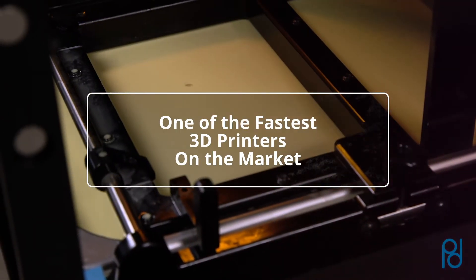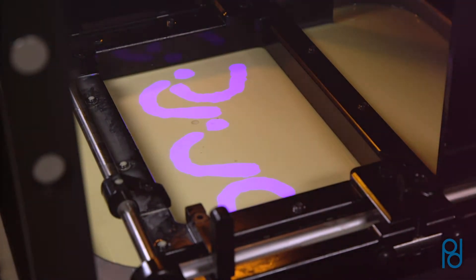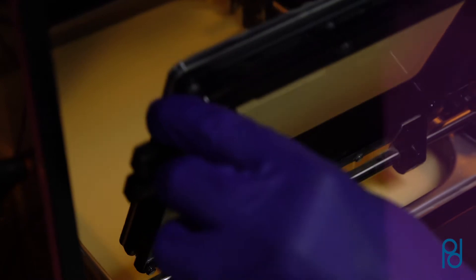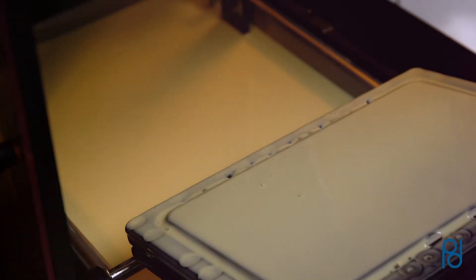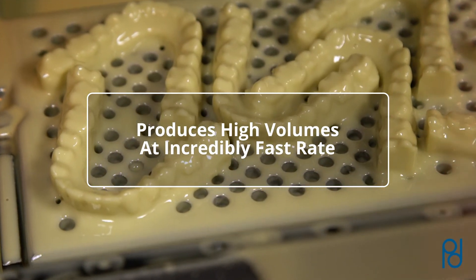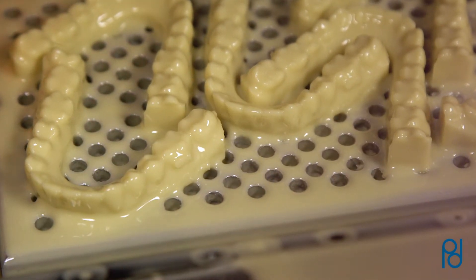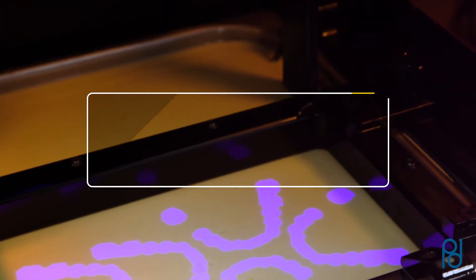JUUL 3D is one of the fastest 3D printers on the market, with builds up to 50% faster than the competition. Because it was engineered using high-end DLP optics and closed-loop mechanics, the JUUL 3D3 printer produces high volumes of surgical guides and dental models at an incredibly fast rate, all without sacrificing quality or accuracy.